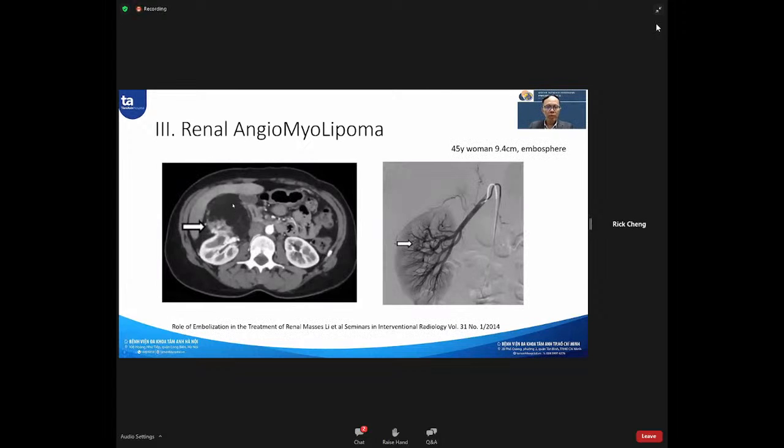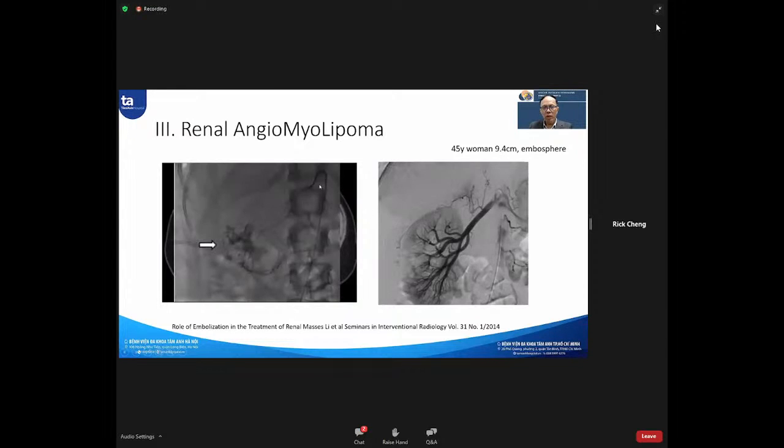First of all, for this case, a big AML on the right kidney, you do the angiogram and see some zones of hypervascularity here. After that you do selective microcatheterization here. You see the whole of the AML here. We do embolization with only Embosphere, under fluoroscopy, and after the re-control you see total occlusion of the AML, and it keeps the normal renal parenchyma very well.